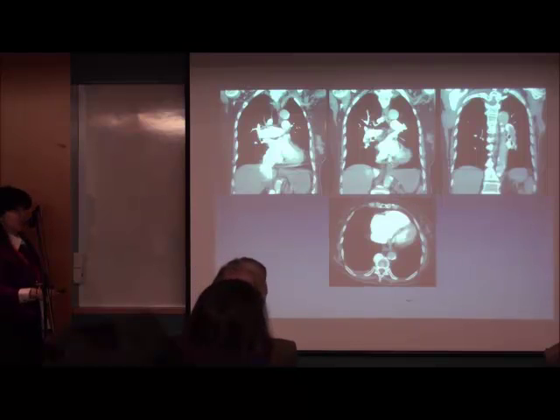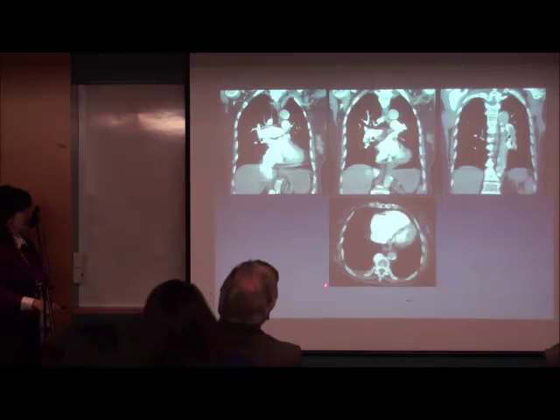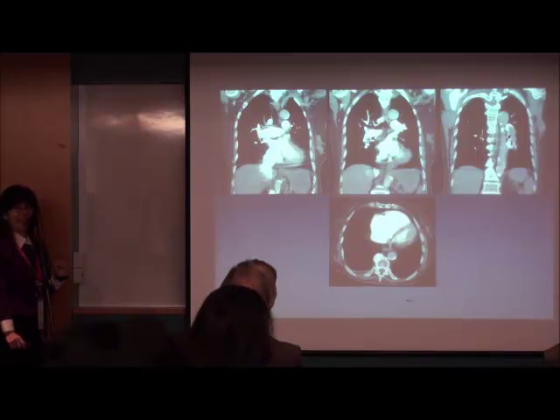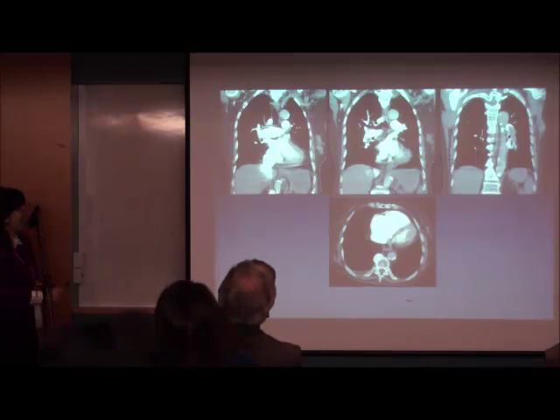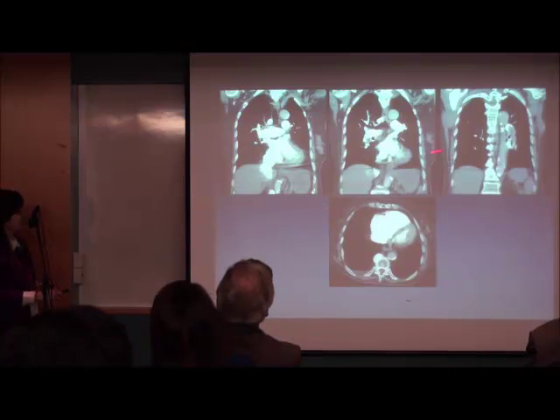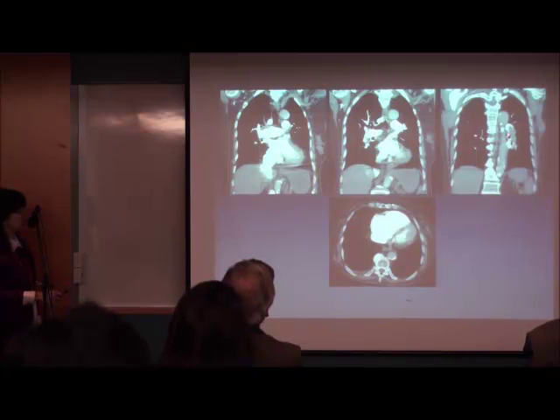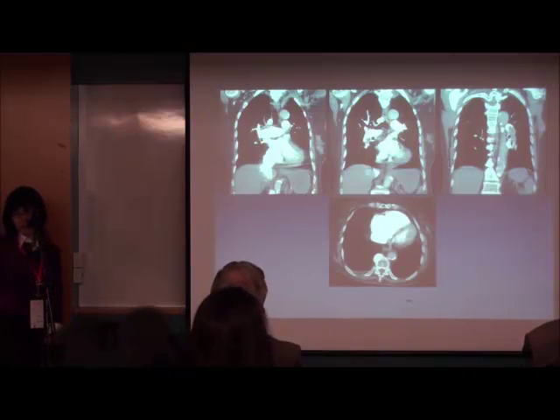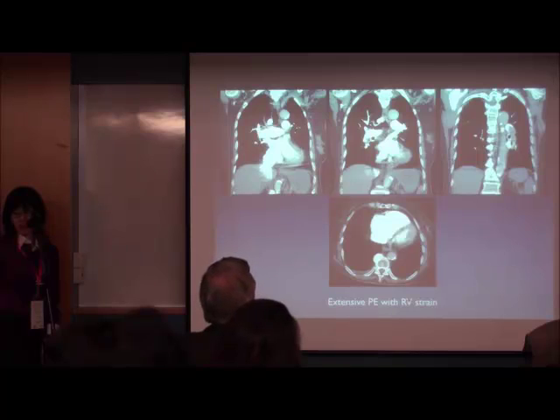Looking at this next scan — most of the contrast is in the right ventricle, so this is a pulmonary angiogram. This patient actually had very extensive pulmonary embolism. This is the pulmonary trunk, and that's the left descending pulmonary artery — you can see a big tubular filling defect. The right ventricle is huge and really dilated. This patient had extensive pulmonary embolism with right ventricular strain.